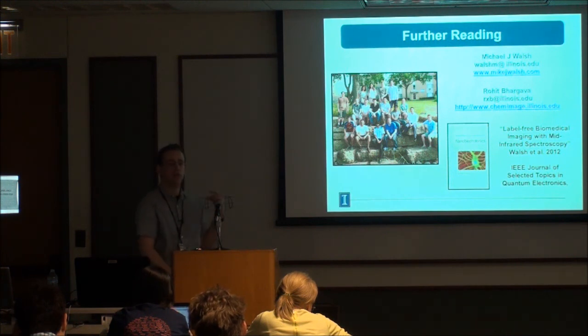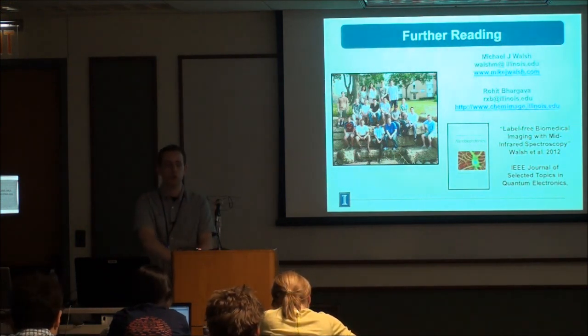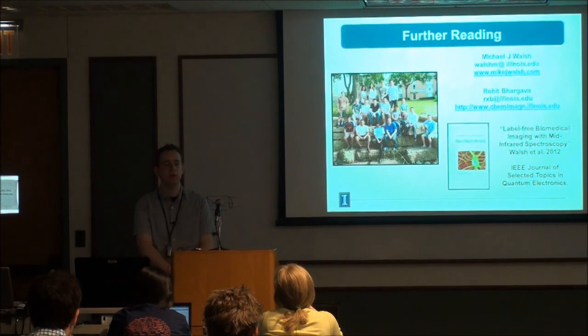These images are huge. Shri acquired the 74x, a whole tissue array of 74x, and was it 400 gigabytes? So MATLAB tends to be very poor at dealing with images that large. ENVI was built for image analysis of, like, geosatellite data. It does very, very good streaming off the hard drive.